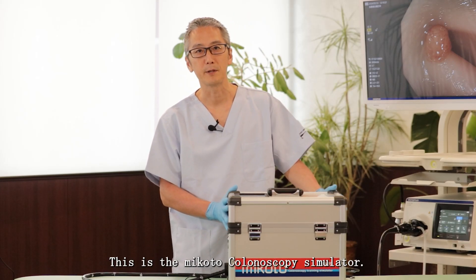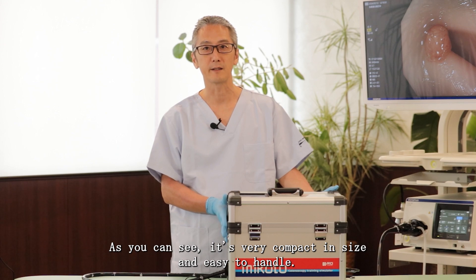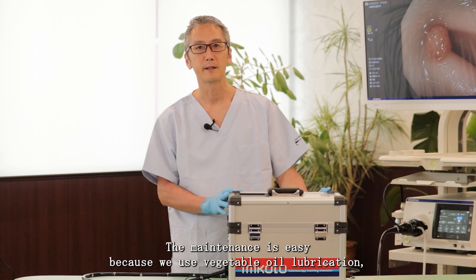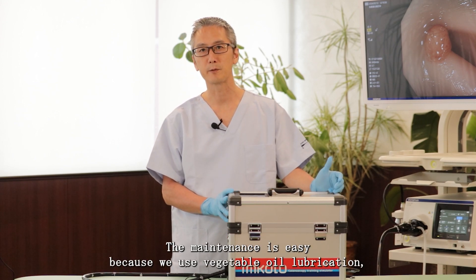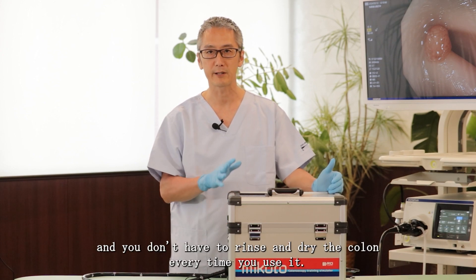This is the Mikoto colonoscopy simulator. As you can see, it's very compact in size and easy to handle. The maintenance is easy because we use vegetable oil lubrication. You don't have to rinse and dry the colon every time you use it.